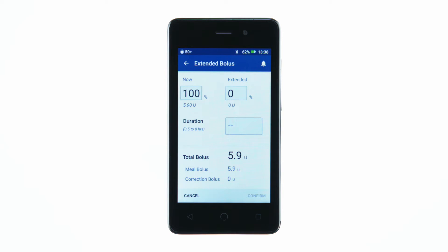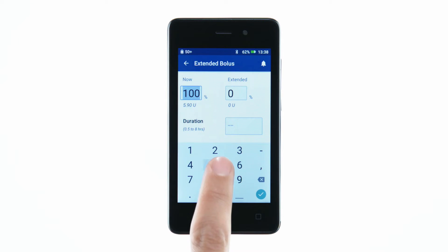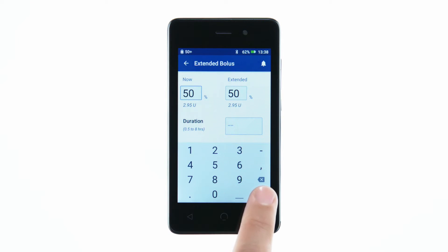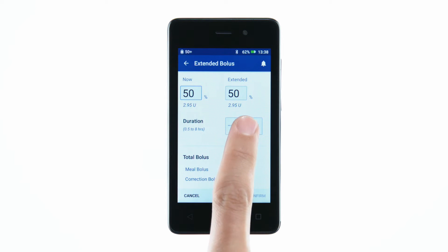Tap the Now field and type in the percentage of the meal bolus to be delivered immediately. Enter the duration for the extended portion of the bolus.